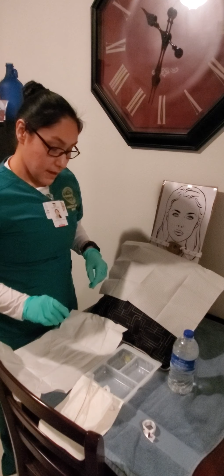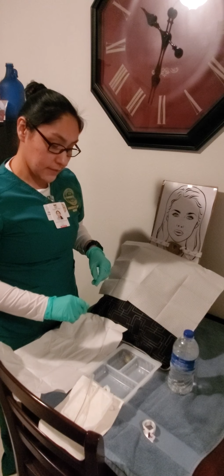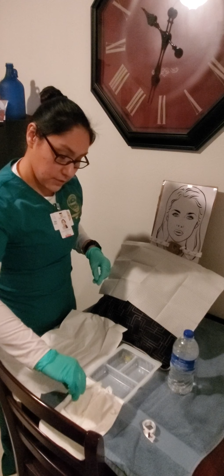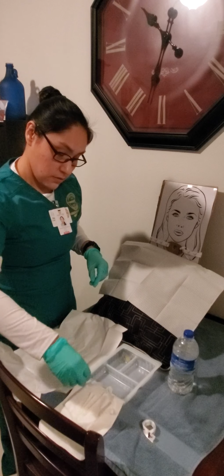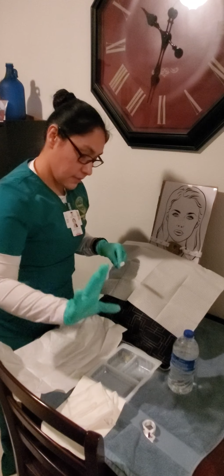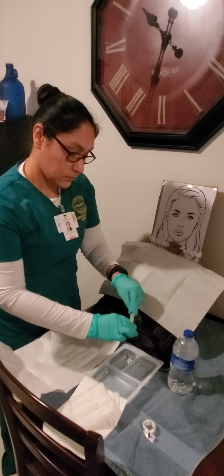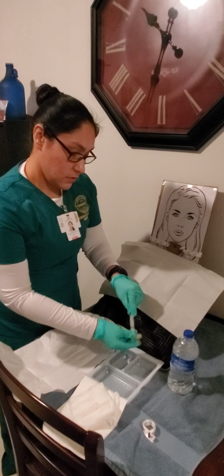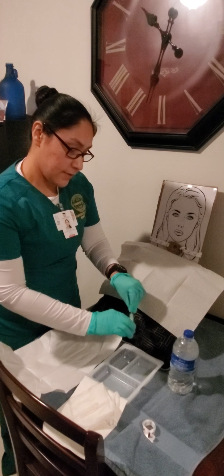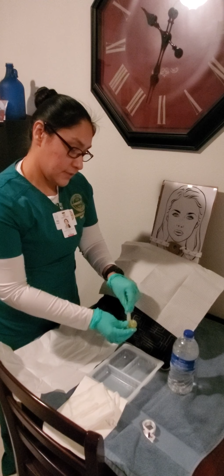Now with my dominant hand, I'm going to pick up the cannula and clean it with the brush. So I'm going to go ahead and get the brush. When you're cleaning the cannula, make sure that you clean the inner and the outer surfaces, just to make sure that there aren't any secretions on there.